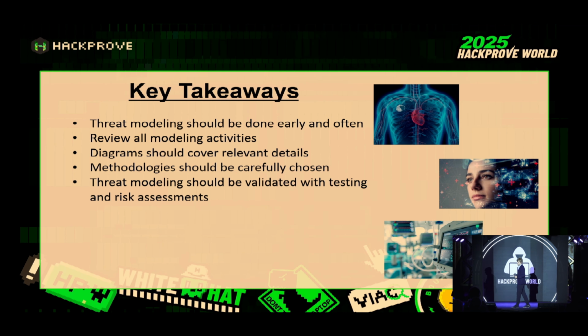Finally, threat modeling needs to be validated. Penetration testing, risk assessment. You have to go through this whole process. Risk assessment and risk management is a huge, widespread area. And understanding everything that can go wrong, trying to figure out how to validate that can be a complicated process. So whether you're doing it yourself for your own product, or you're a freelance tester, or you're doing it at an organization, having a very stable risk management framework is important to make sure that nothing slips through the cracks, and this is done pretty often.